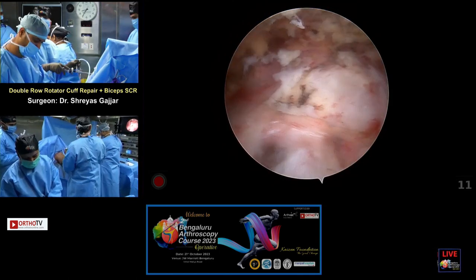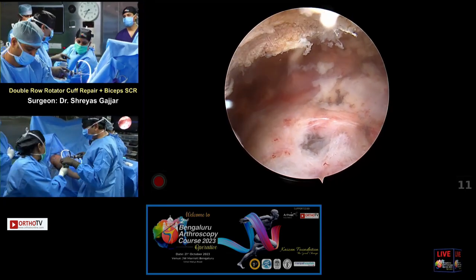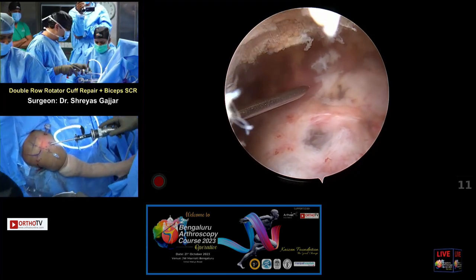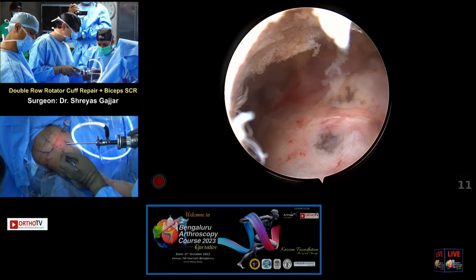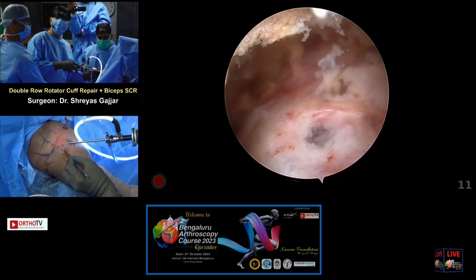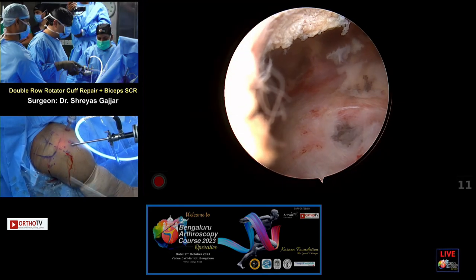So I'm going to make my mid-lateral portal. I don't know if you have the outside image. I've done the surface marking, which is very important. So. Okay, knife, please. Thank you. Perfect. Now, please take this off. Thank you. So, would you say that will be about two finger breadths below the lateral margin of the acromion? Yes, absolutely.